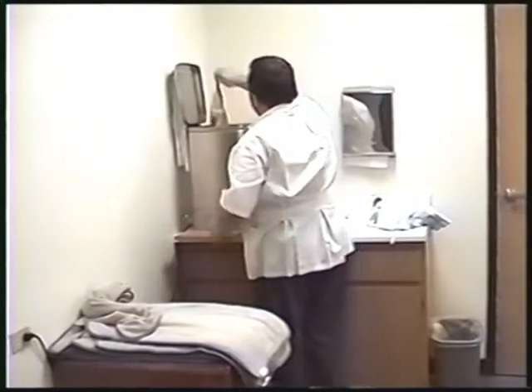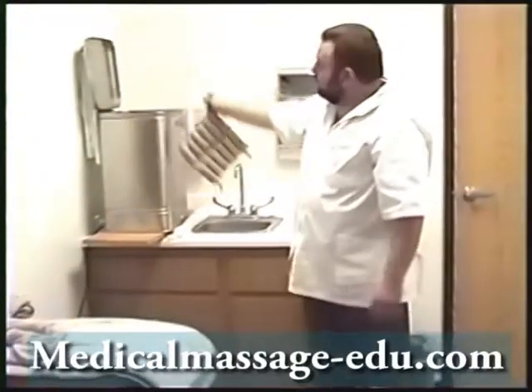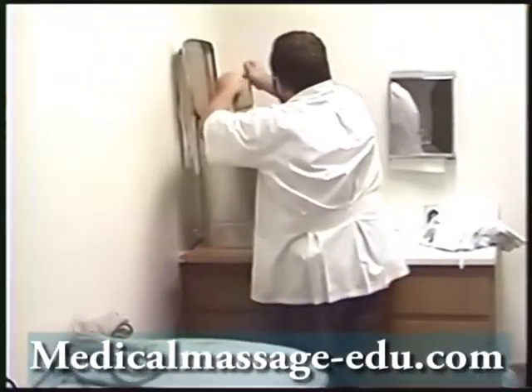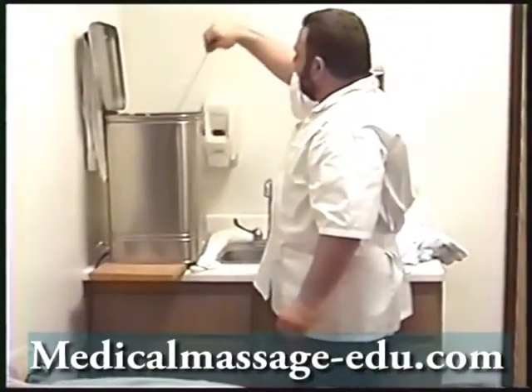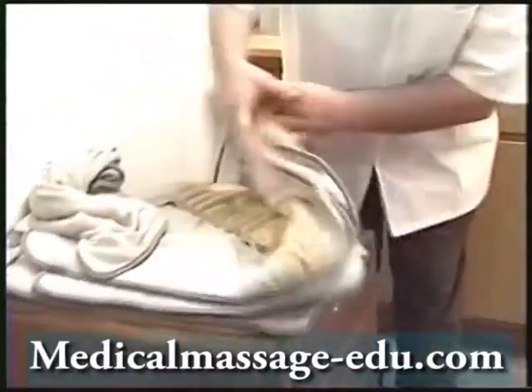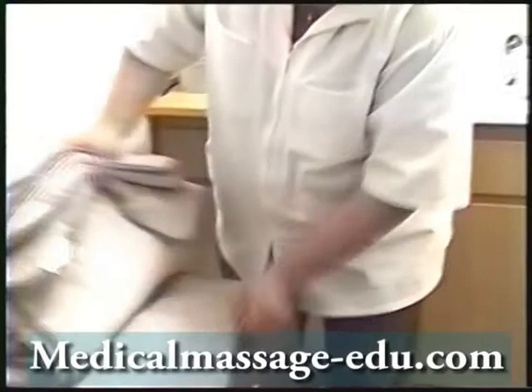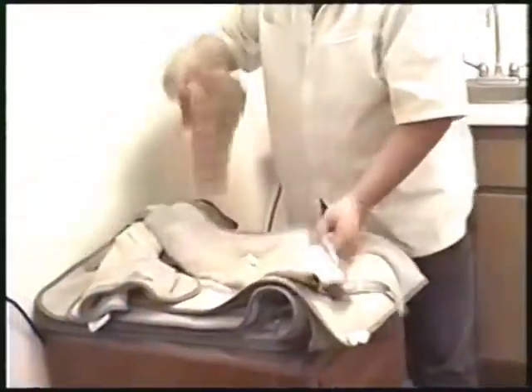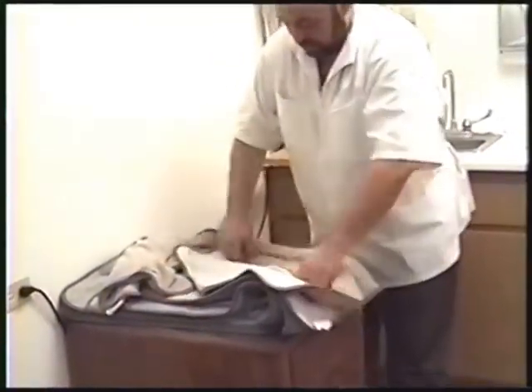I will show you a few different sizes. This is a smaller one — we use the same isolation layers. For smaller particular areas we use the smaller hot pack. We also have special equipment to handle and remove them. There is also isolation here. This smaller pack is designed on purpose so we can use it on the neck — we apply this hot pack on the neck like this.